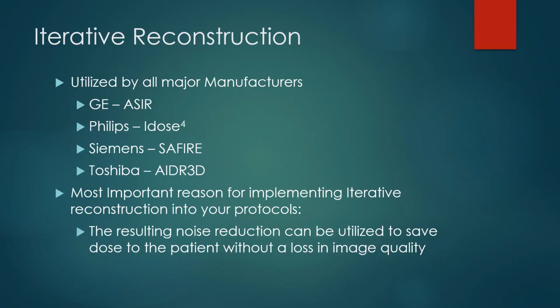The most important reason for implementing iterative reconstruction into your protocols is the resulting noise reduction can be utilized to save dose to the patient without a loss in image quality.